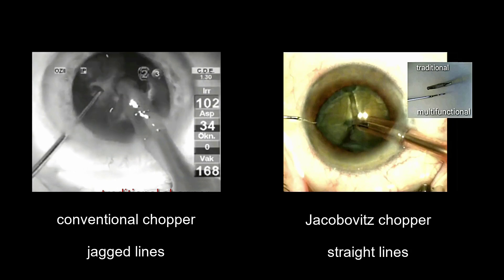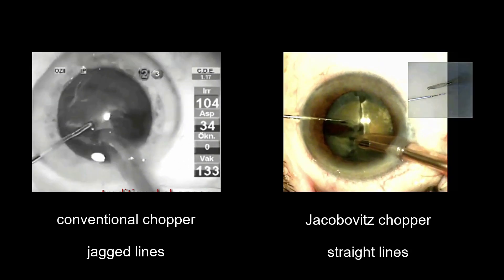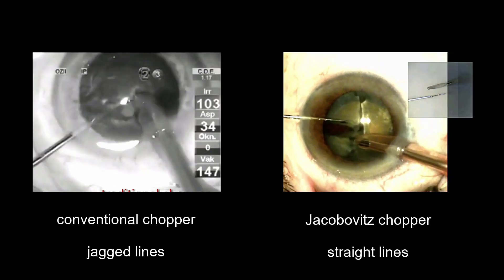A conventional chopper divides the lens in unpredictable jagged lines, whereas the Jacobovitz chopper cuts through the nucleus in predictable straight lines, offering more control.